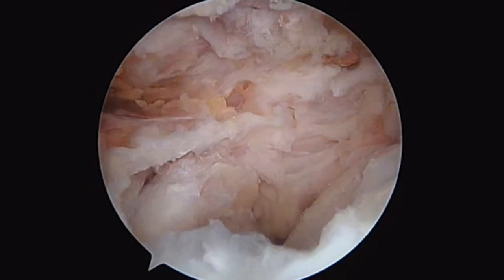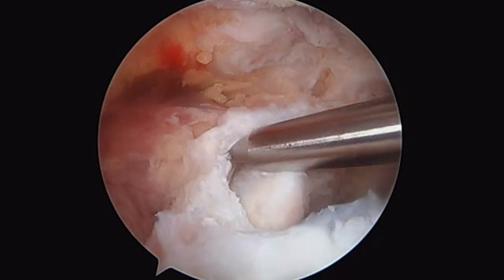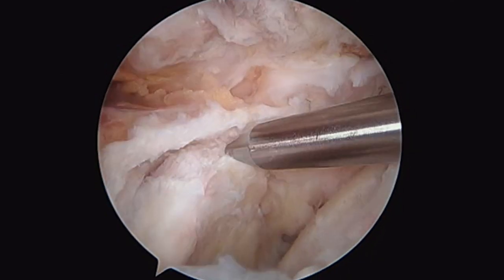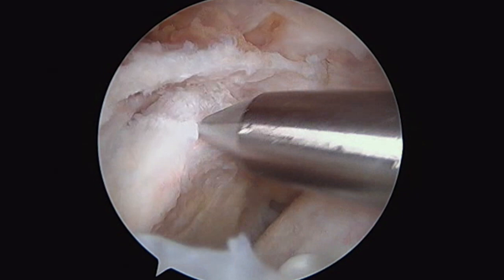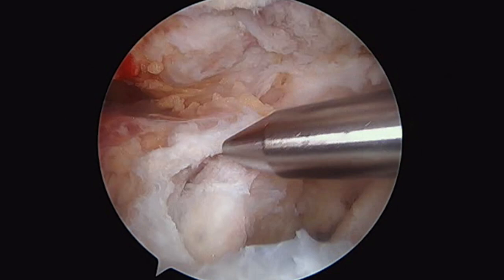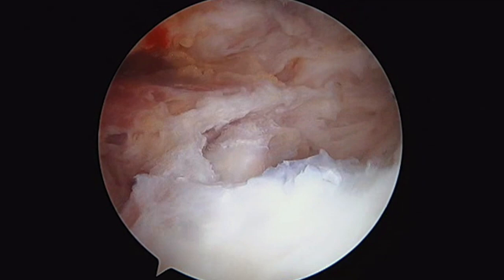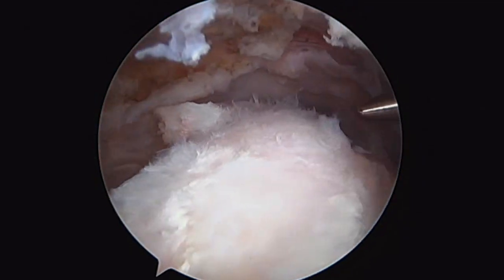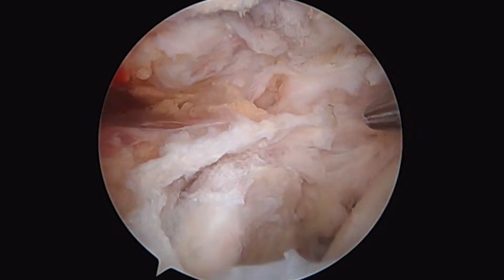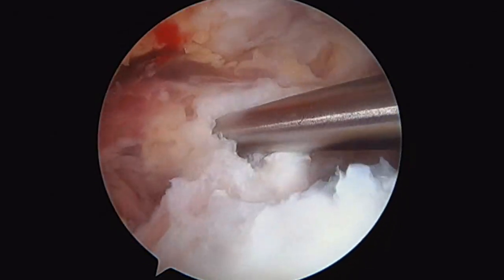This is the humerus. You can see this big gaping hole right here. This is the cuff. We typically define a massive tear when the cuff is retracted to the level of the glenoid. There you can see the shoulder joint. If you're in the subacromial space, you shouldn't be able to see the actual glenohumeral articulation because the rotator cuff should cover it up. This is a massive retracted rotator cuff tear.